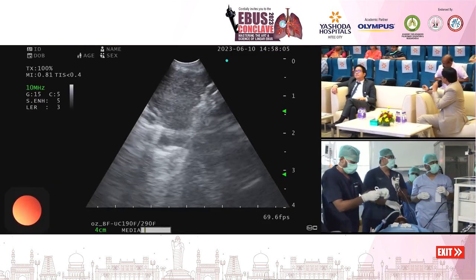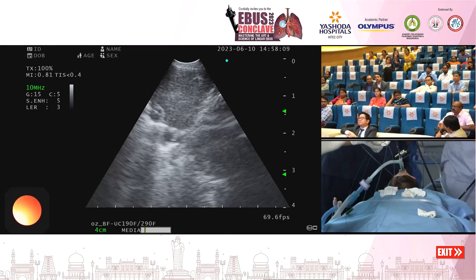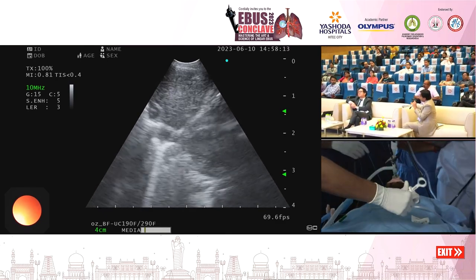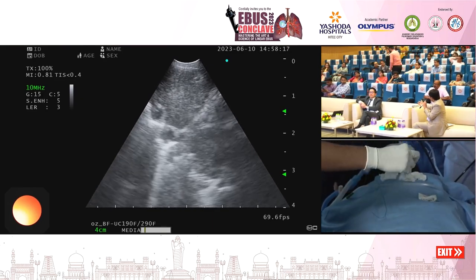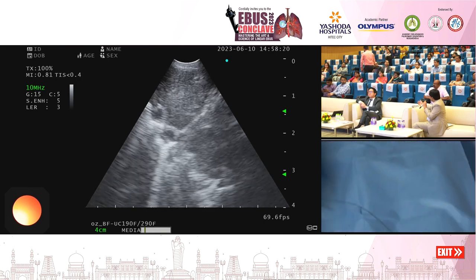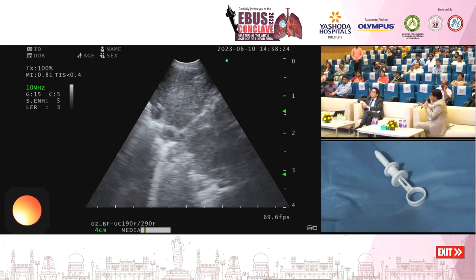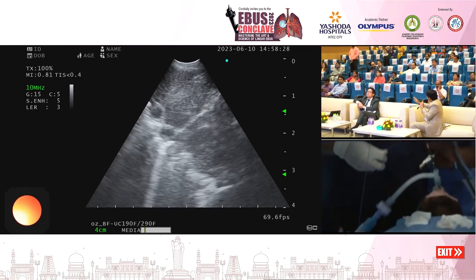Cryo, yeah, no. Actually speaking, 1.1 is the safest and probably the only. I have come across only one article where they managed to pass 1.7. I am surprised how they could put a 1.7 cryoprobe into the node. But there is one publication where they did. I would not ask anyone to put a 1.7 into the node. 1.1 is sufficient to get us full tissue.